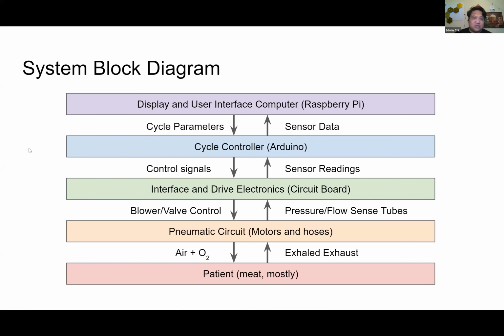The cycle controller is operating at about 100 times a second, making changes to the throttle on a 1/10 or 1/100th of a second cycle. The display interface operates on the user cycle, which is from breath to breath, so every 10 seconds or so, and between times that the user will change settings, which will be on the order of minutes, tens of minutes.